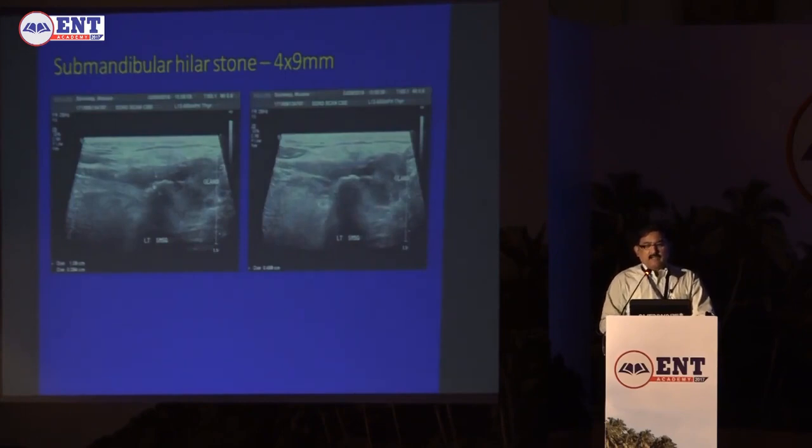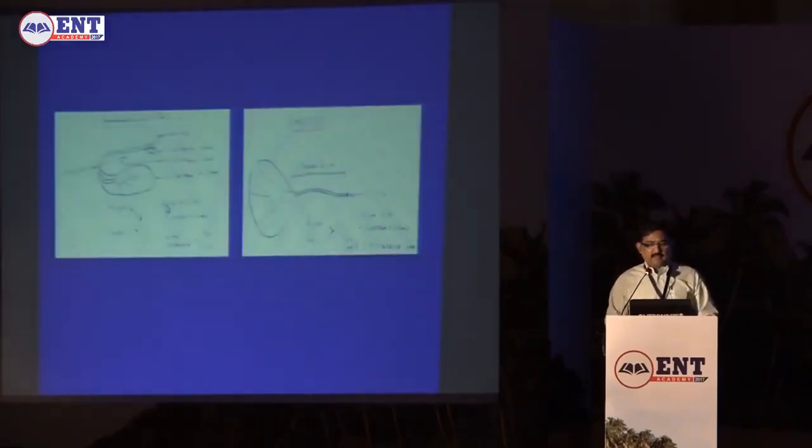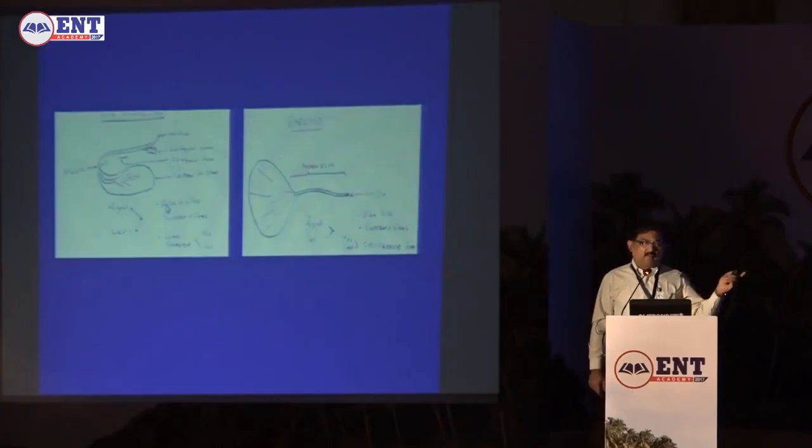This is a hilar stone. Forgive me for introducing this term without a picture, but I'll show you the picture very soon. This is the picture. Now, before I send a patient, if any of you want to copy one slide from this presentation, copy this slide, because this is a picture which you can draw on a paper and send to the radiologist to show the location of the stone.